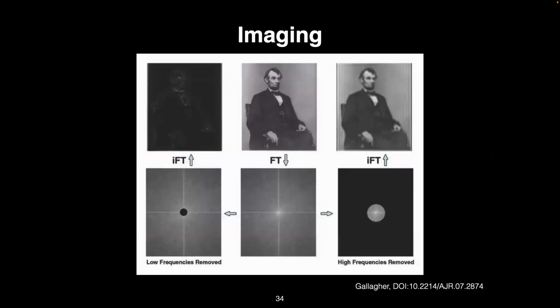So if you take that Fourier transform and you try to go backwards, but just using components of it, you can see that if you just take the outer edges and don't use the middle information, you get a lot of the edge information and details. And if you do the inverse using just the middle, you get most of the energy and a lot of the features, but you're missing a lot of the detail that you would normally get from these outer points.